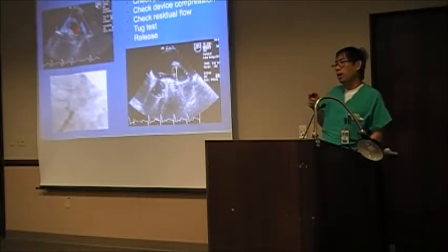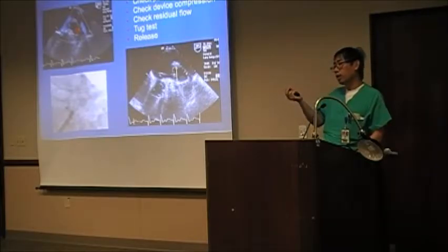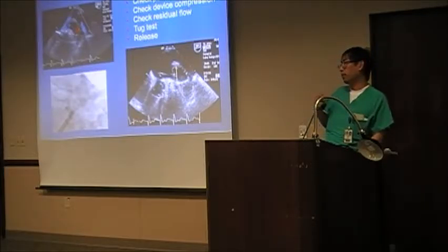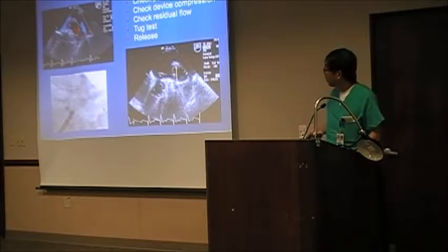This year, the Heart Rhythm Society meeting talked a lot about the risks with the Watchman. From what I heard, if the closure is not very tight, blood can still go in and out, and clots can still build up, so there is an issue with this. Some people, after the procedure, developed heart perforation, pericarditis, chest pain, fibrosis, a lot of issues with this.